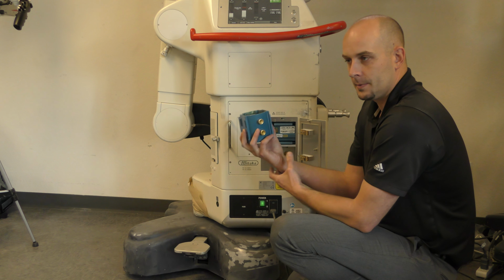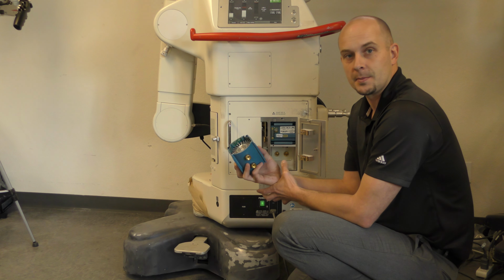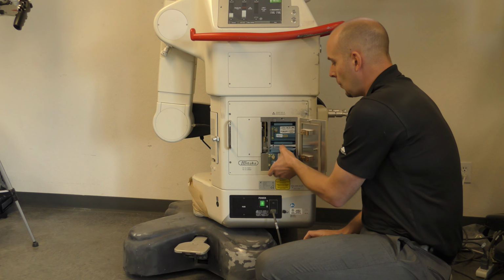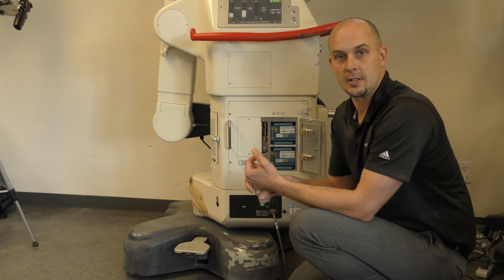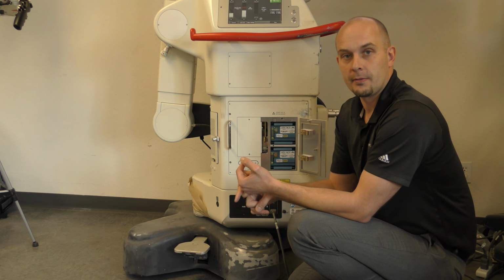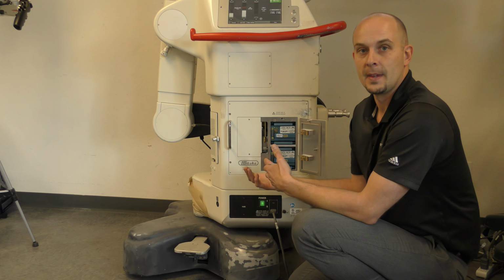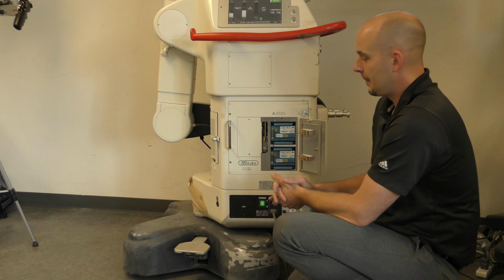So this bulb, for a 400 watt bulb, it's $1,350. For a power supply, your customer is going to pay upwards towards $10,000. The way I approach it with the customer is I tell them it's just like doing oil changes on your car. If you don't do oil changes in your car, the amount of cost that's going to be accrued in those repairs is going to be immense. Same deal here. So we want to train the customer to always change these out at 500.